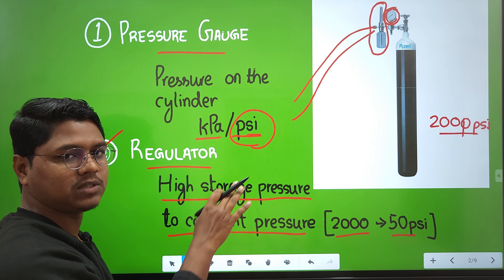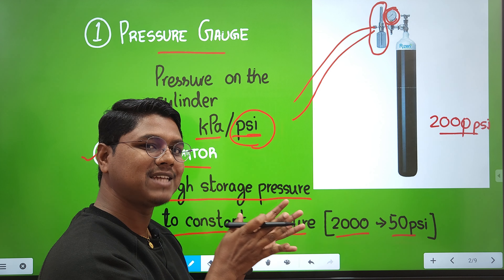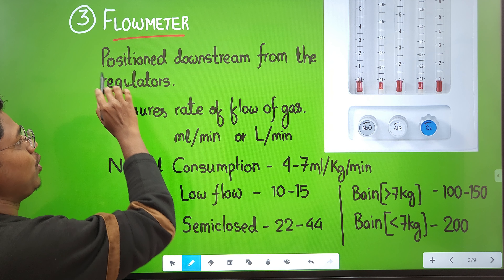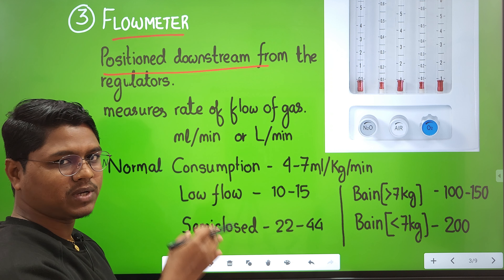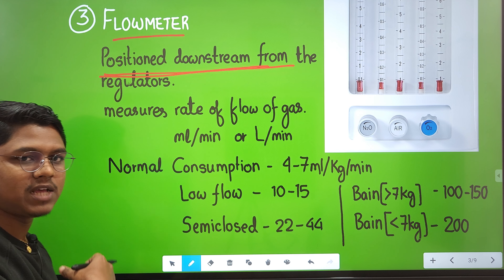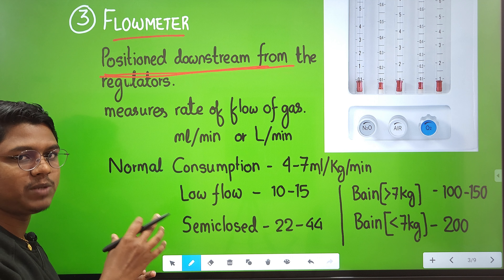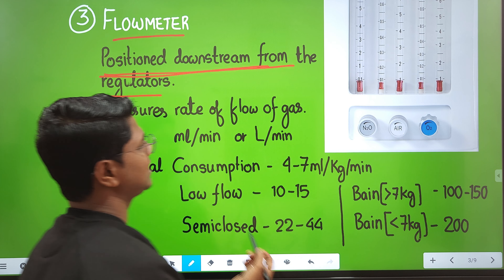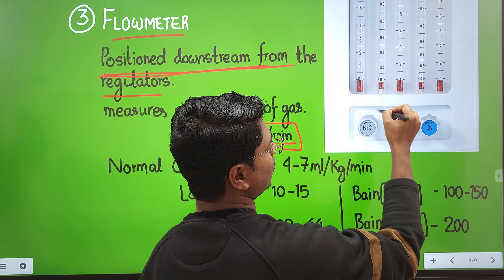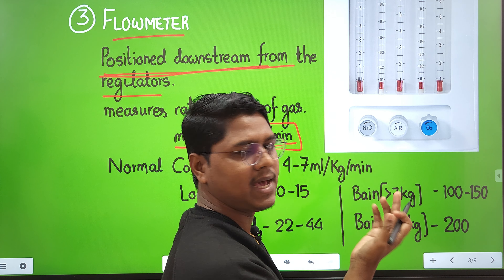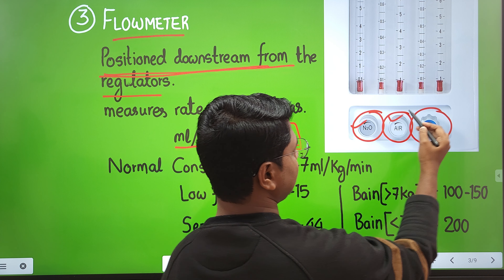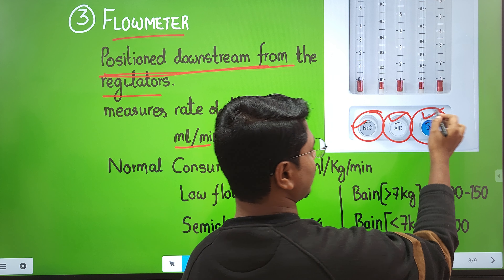The next component is the flow meter, positioned downstream from the regulator. After the gas has been decompressed to the regular supply pressure of 50 PSI, the flow meter measures the flow rate, usually expressed in liters per minute. In this picture you can see three flow meters: a nitrous oxide flow meter, an air flow meter, and an oxygen flow meter. These knobs are used to control the flow.